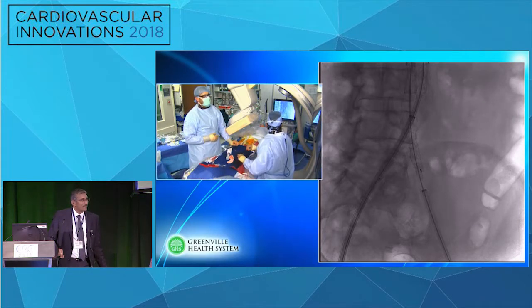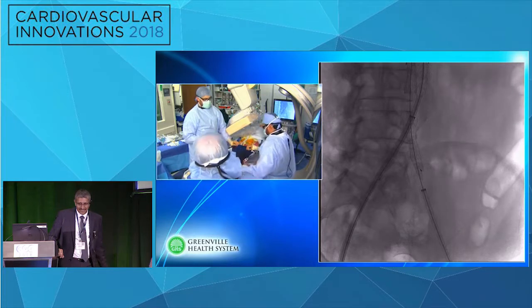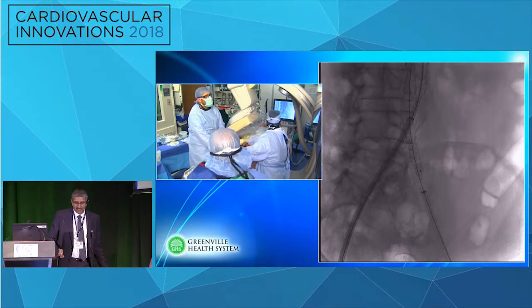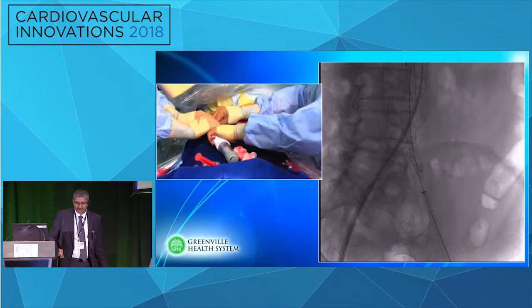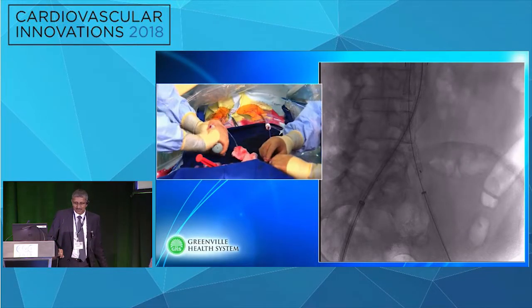So we'll take my device out, and you see the calcium on my side. Let's go ahead and pull your sheath back. So I've got your device here. Put your sheath back. Yep, there we go. Get a little bit more. There we go. All right. Let's go ahead and finish deploying your device. Kevin, if you can walk this off.